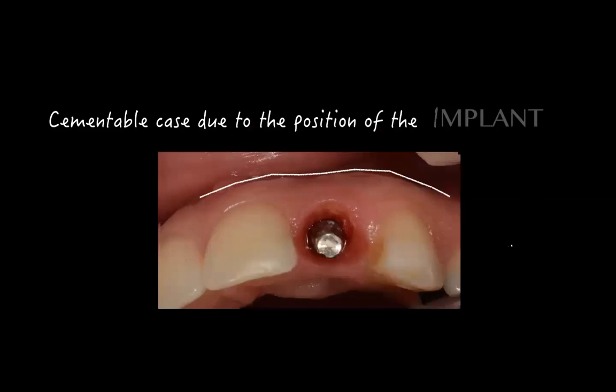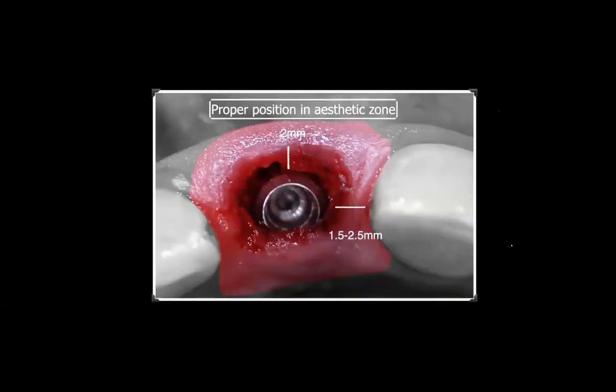So here is a cementable case, okay? Again, the implant was placed. I did an immediate load. I did it as a cementable case on a solid abutment, and then finished it and went on with that case. Now, here is where you generally want to be in an aesthetic zone, okay? You want to create that 1, 2, 3 idea that I just gave you.